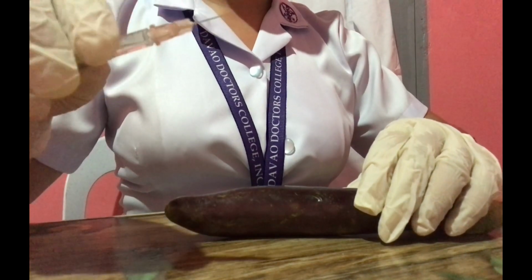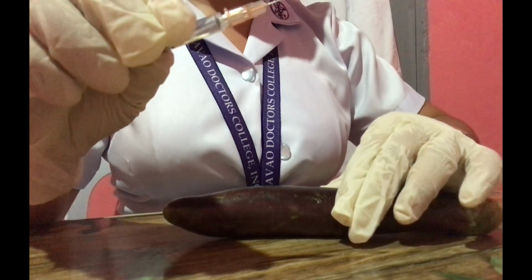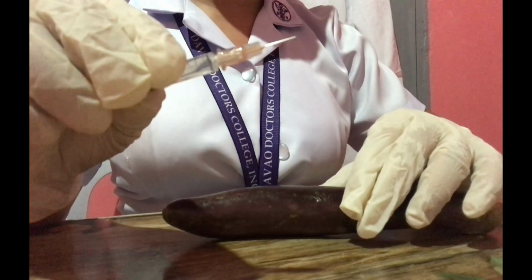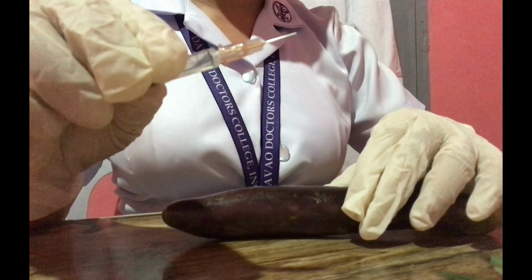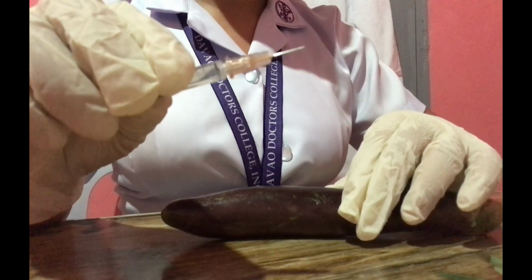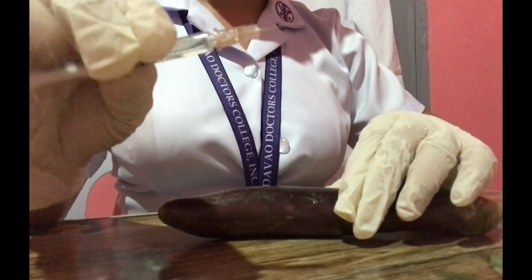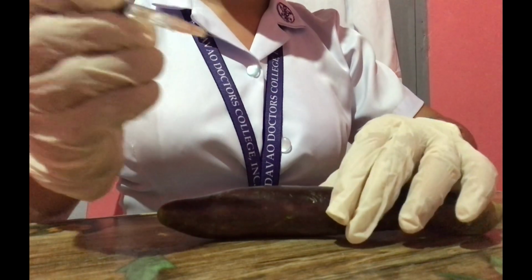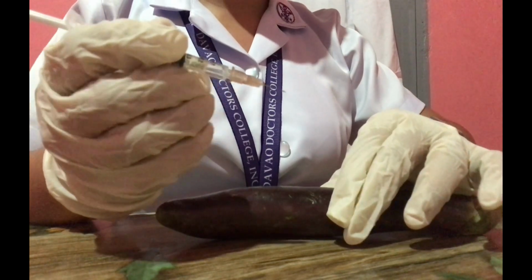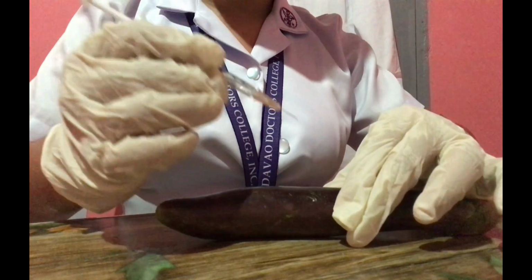Prepare to inject. Using your non-dominant hand, pinch the skin. Hold the syringe in your dominant hand between your thumb and fingers steadily, as if you are holding a dart. Depress the plunger with a slow, even pressure. Then inject the medication into the patient.